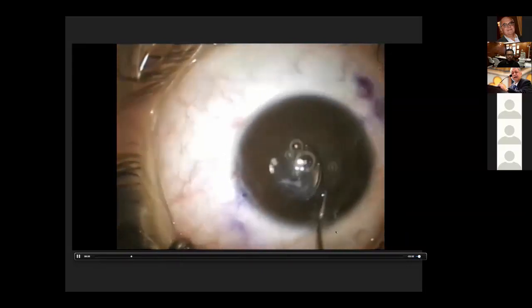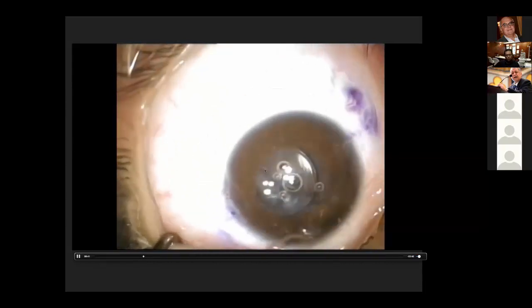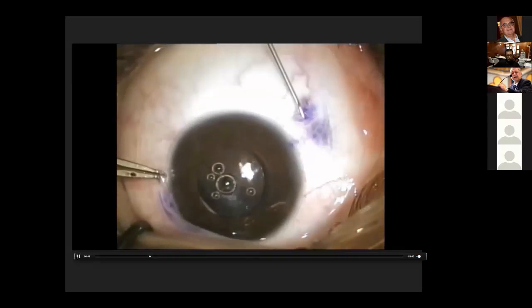Okay, so now I'm trying to deal with the capsule, with the lens, to see what's happening. The lens actually is put in the sulcus, and the whole capsule is crumpled behind. To clarify things, this lens is actually in the sulcus. The whole capsule with the phimosis is pulled down here and fibrosed and wrinkled, bisecting the center. So the decision now, I said, I will fix the lens first and then deal with the capsule which is present behind the lens, to have at least support, not to lose the capsule first and then while trying to fix the lens, I can lose it.